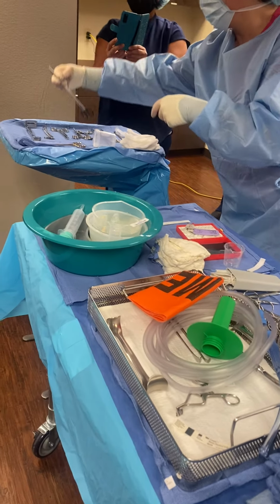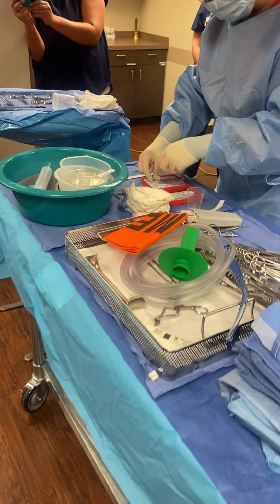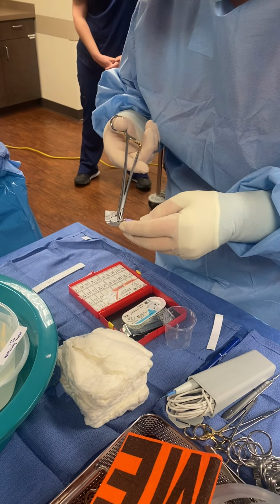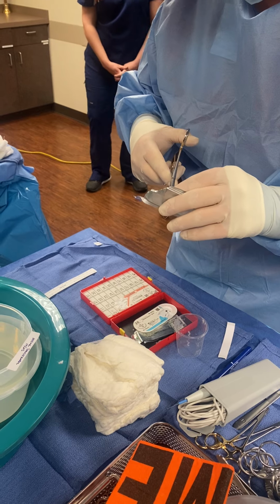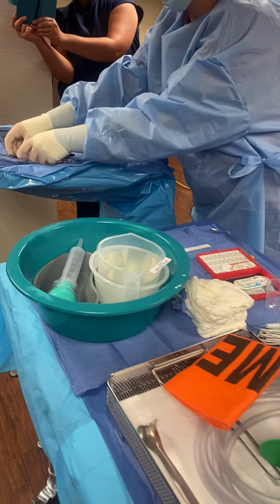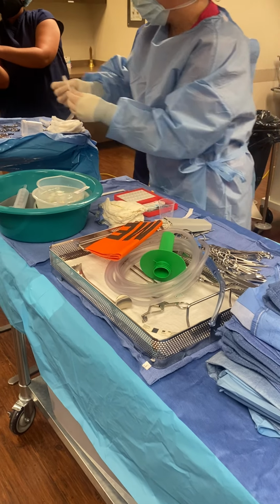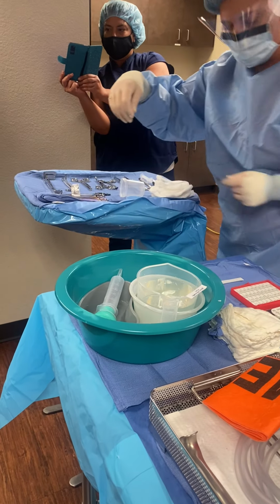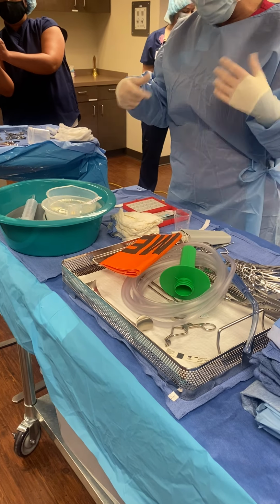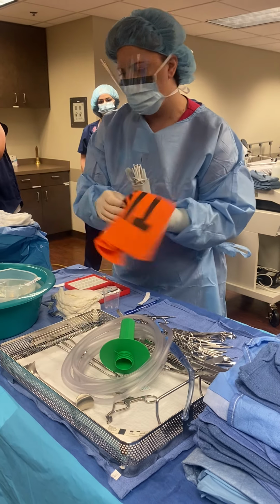All right, so I'm ready with that first stitch. And then I usually get the first closing stitch ready so that there are two that are available. And I just stick them into this towel. And then my last one, I usually put under here so that I have it with me. But again, if you feel more comfortable keeping them back here, or depending on what your hospital policy is, okay? We can change that up.